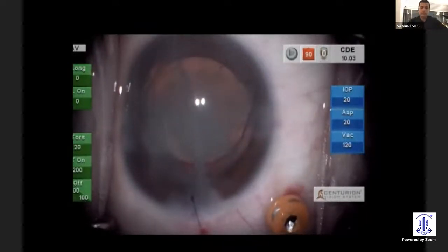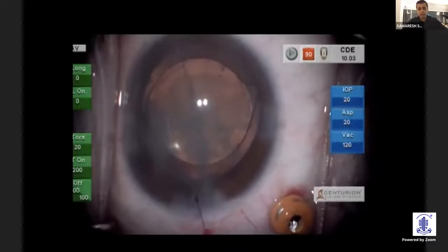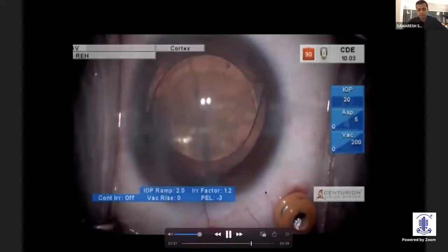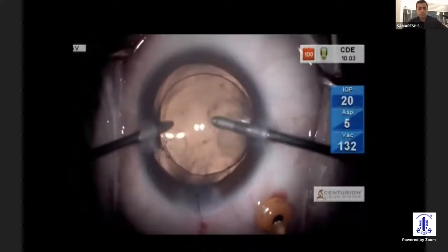It is important to make sure that there's no vitreous left behind. So I use diluted triamcinolone in the anterior chamber to look out for remnants of any vitreous. It's also needless to say, you have to suture these incisions because it is a situation of compromise. And I prefer to use 1 or 2 sutures on my main incision.